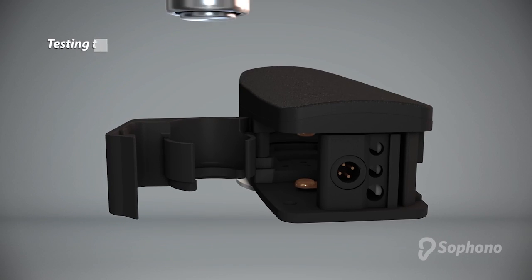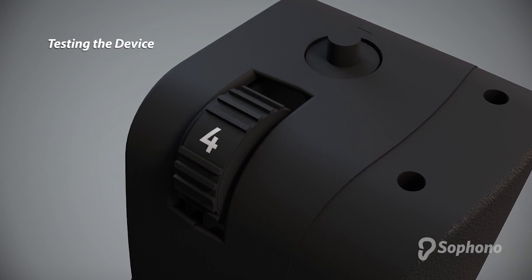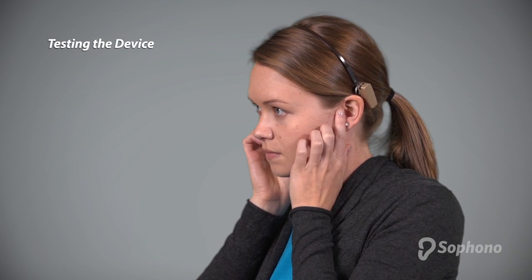To test that the device is working correctly, insert the battery, turn the volume all the way up, and place the device on your head. Then plug your ears for maximum effect.